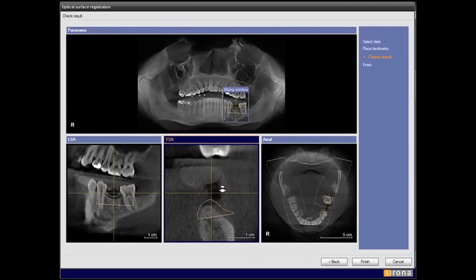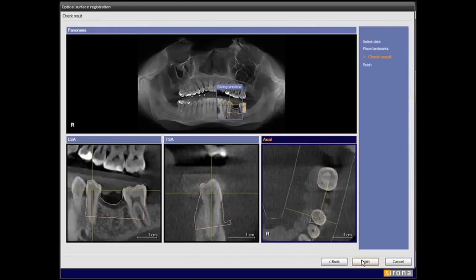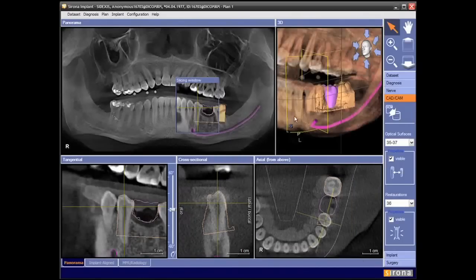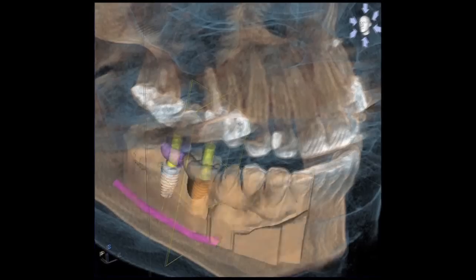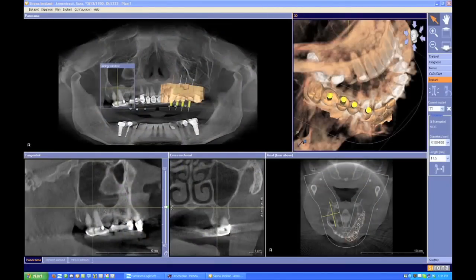Now you have the two integrated and you see where the tooth is supposed to be in 3D. What implants do you have to choose from? You can pretty much use anything you want. They've got a library of every single available system, so you're not tied into any one system. We do a couple different systems in our office, and I can select every single one. Updates are coming out constantly, so the implant library includes every system out there. The system will adapt to what you're doing.